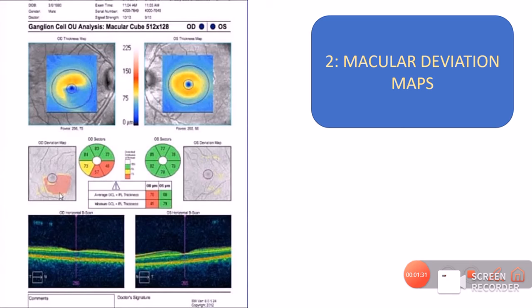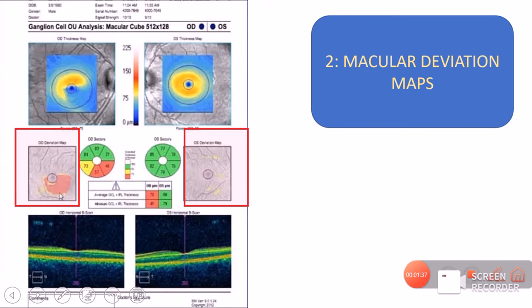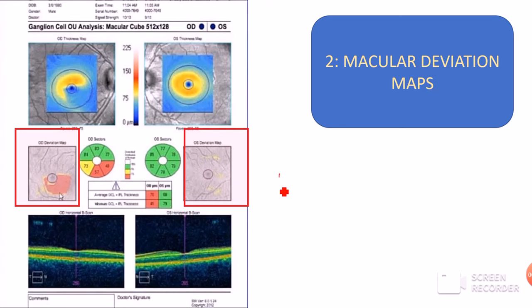Just like the RNFL deviation maps, the color coding of the macular thickness deviation maps is the opposite of the thickness maps. A red zone in the deviation map means that thickness is present in less than 1% of the population — these are the dangerous zones. In this example, the thickness map showed bluish color, and in the deviation map we see a reddish zone, confirming this falls under the category where only 1% of the population would have such thickness — indicating abnormal thinning.